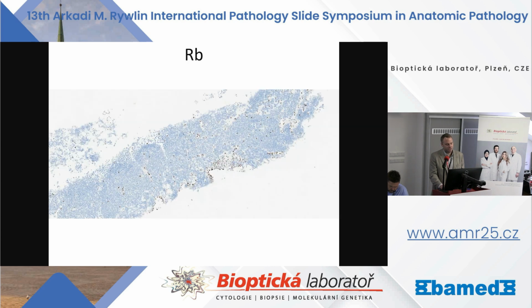RB is lost in this, so that really pushes it even further towards small cell carcinoma. It also had quite classic morphology, as I was mentioning. This has been a known phenomenon for at least 30, 40 years: about 10% of small cell carcinomas lack expression of neuroendocrine markers.